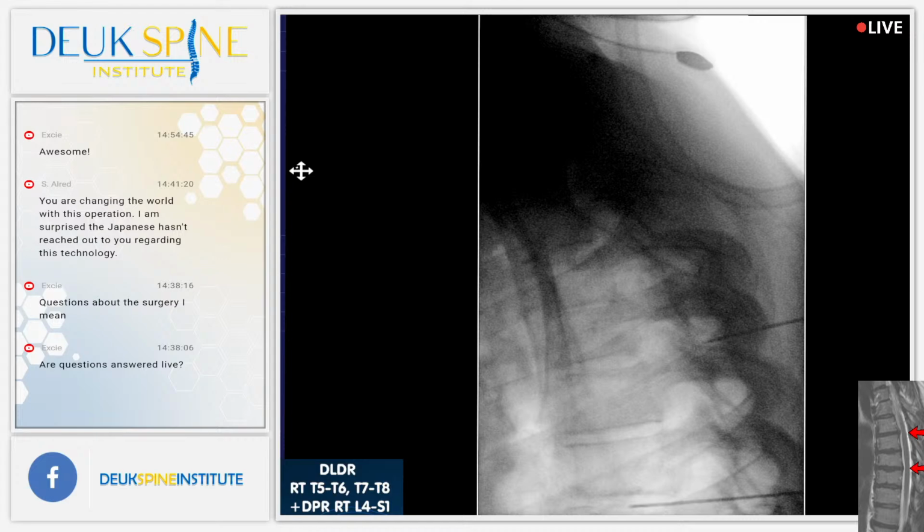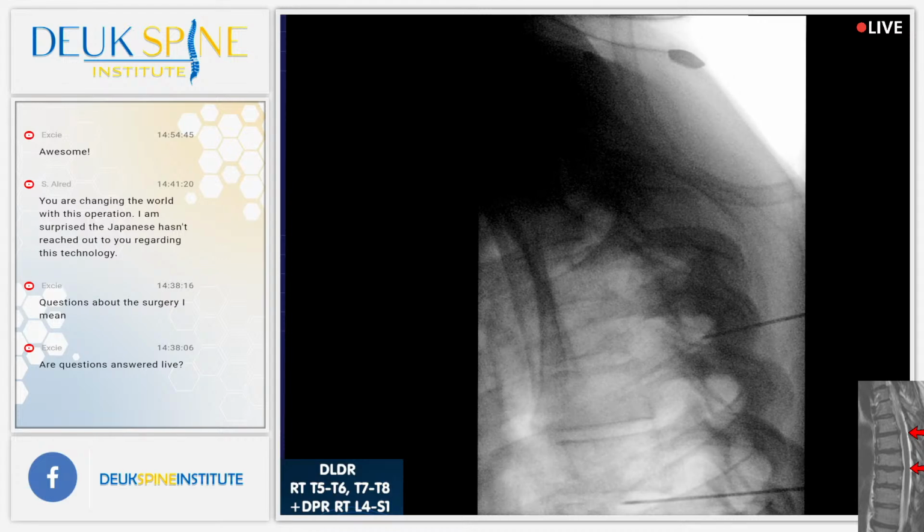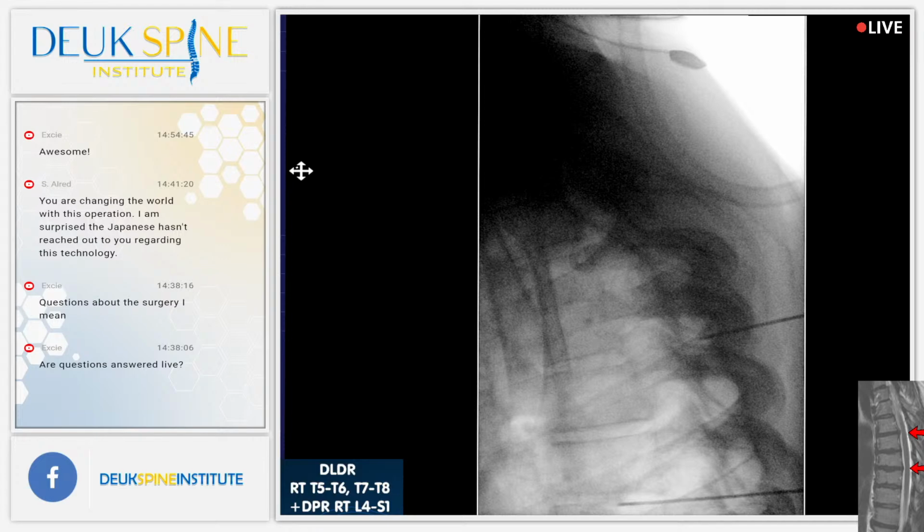All right, you want to show me what you've got, Jordan? Once again, we're adjusting the x-ray, the position of the fluoro relative to the spine. Those are the posterior elements. If you look, 6 lines up nicely. It's just 5 that's a little bit difficult to see. But 6 pedicles are good. 6 is off on orbit a little bit. Can you reorbit 6? Let's just look at 6. If we can get 6 good, then maybe 5 will come into view. That's a little bit better.